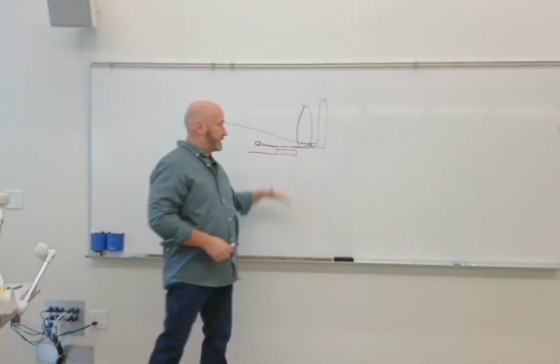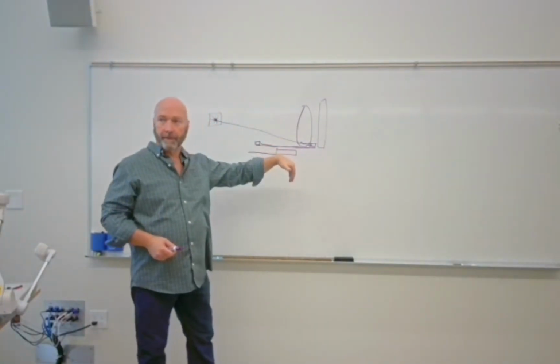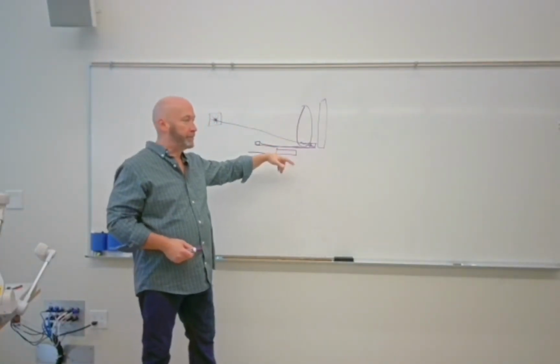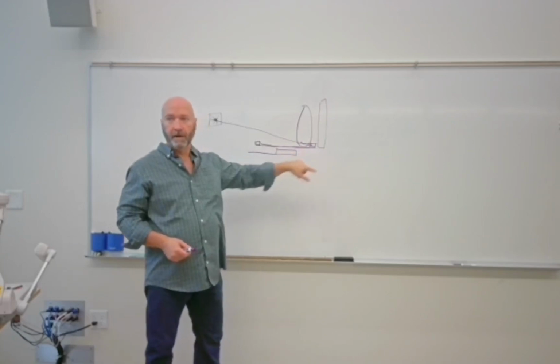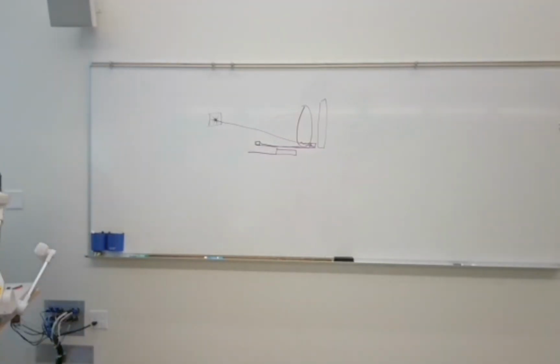You've reduced your OID, so you've increased your sharpness of recorded detail for anything that you shoot into the bucky. But if you're doing decubs, you've got a little bit of a problem. You can overcome it, but it is a little bit of a problem. So most of the time, again, they're going to be carbon fiber. You may have some other material as well, but they definitely have to be radiolucent. Can't be a metal tabletop. And they have to be uniform thickness.